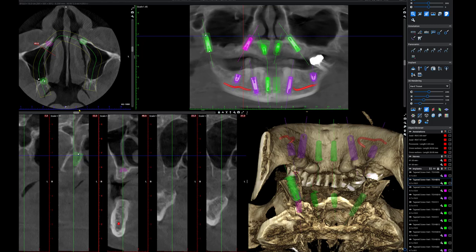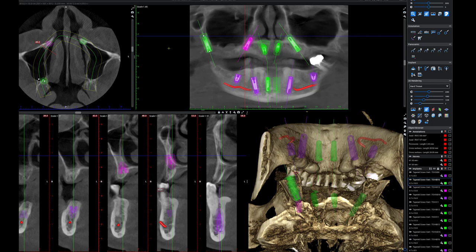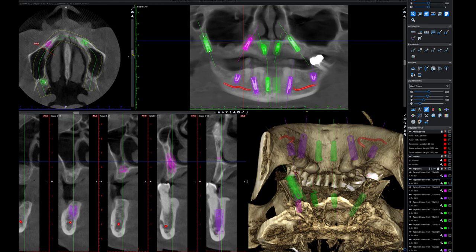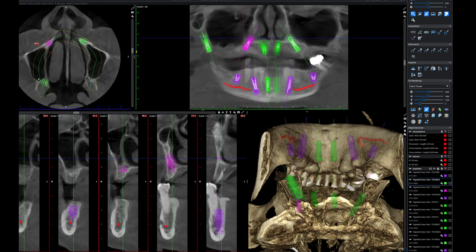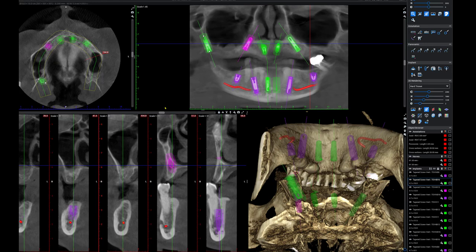I'm going to lean this back just a little. Now we're going to look through the axial slices — it looks like we are right in that pyramidal process. Now for the patient's left side, I'm going to slide over here.